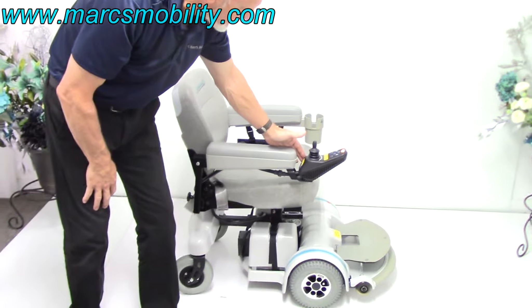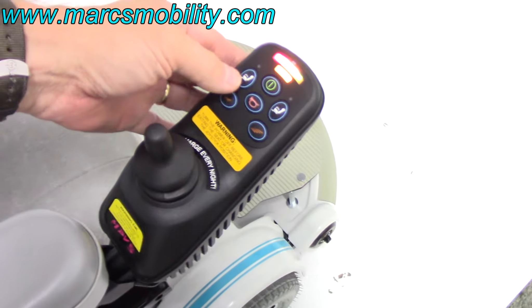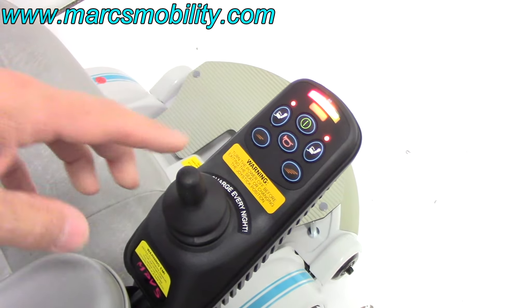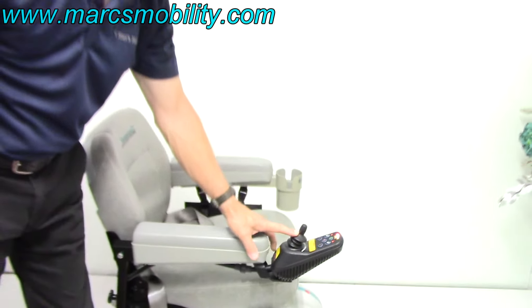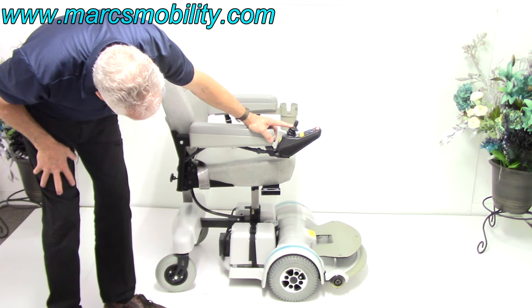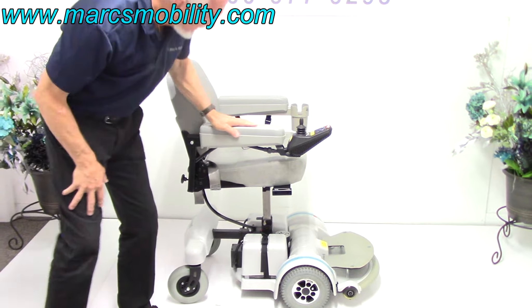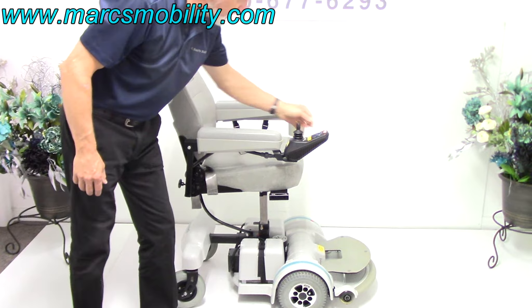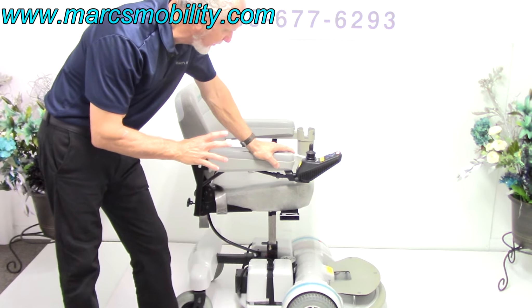The first thing I want to show you is the seat lift. To work the seat lift, you go on the joystick right here and hit the button where the seat lift is. Push it forward — you can see the seat lift going up. This is your 5-inch seat lift. The chair will not drive with the seat elevated, so it's a safety feature.